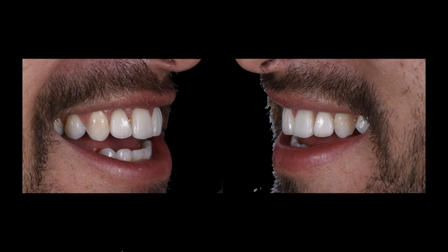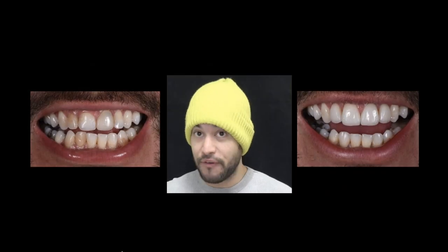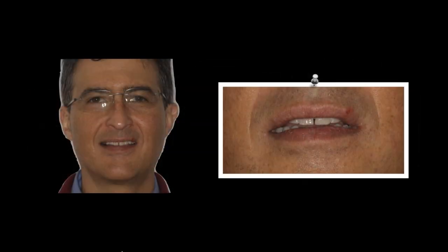So there's final restorations. And again, the management point in this case for me was knowing what to do and what not to do, meaning, did we want to touch those cuspids or not? It was smart that we didn't, and yet we still tried to stay as minimally invasive as we possibly could to deliver what we wanted. I won't go through the video, it just takes too much time.